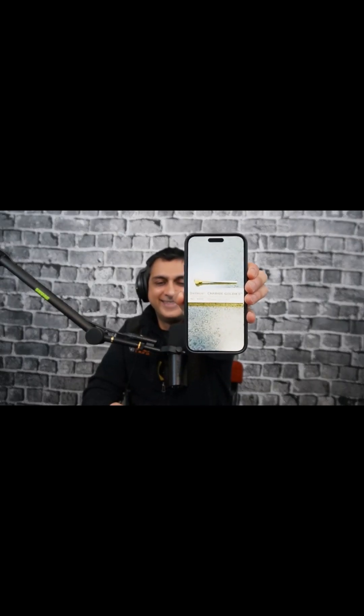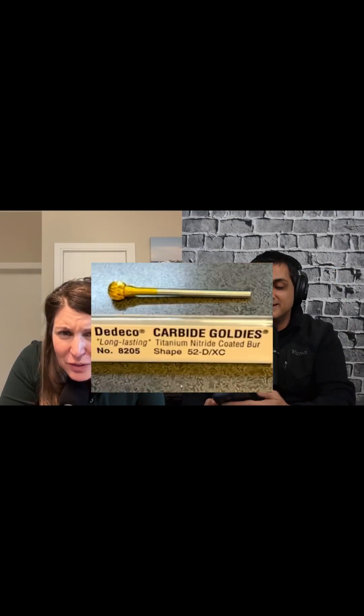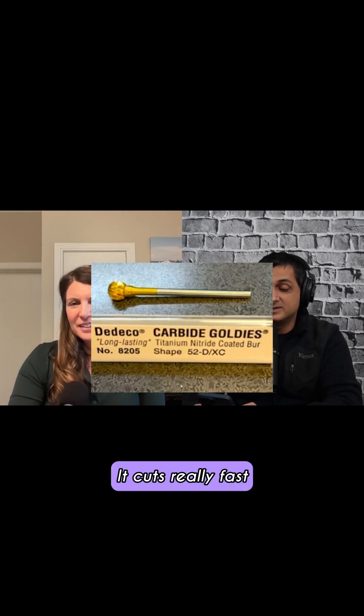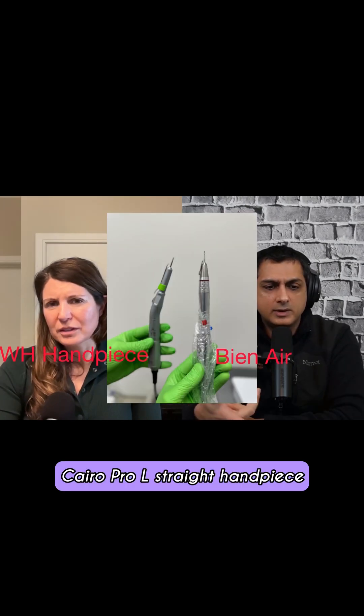I use this bur. This is really a ghetto way to show a picture — a carbide bur. It cuts really fast. So I use an electric handpiece. Cairo Pro L straight handpiece.